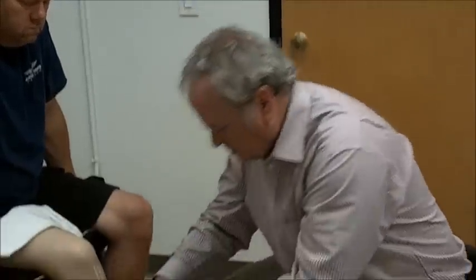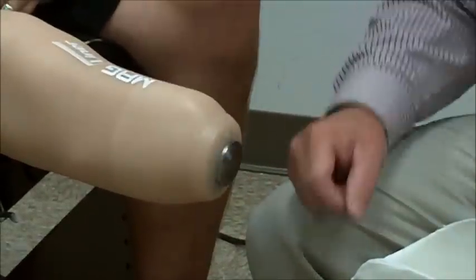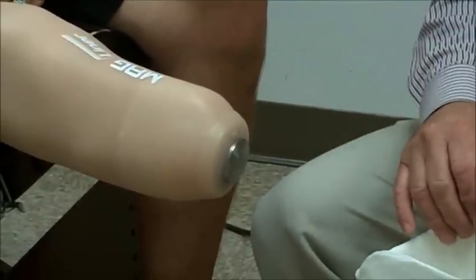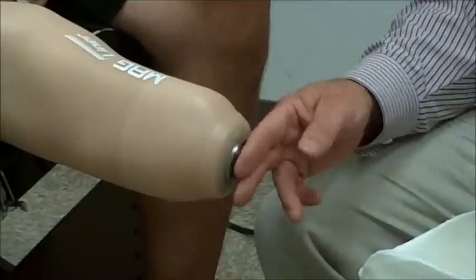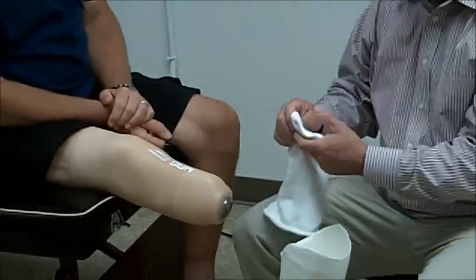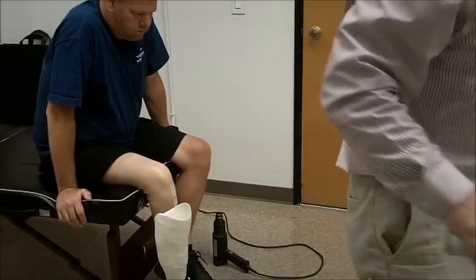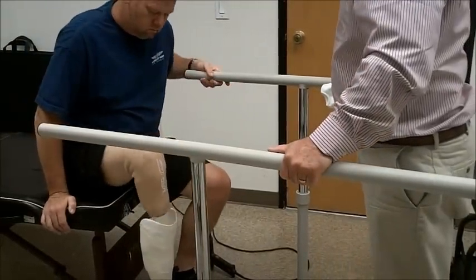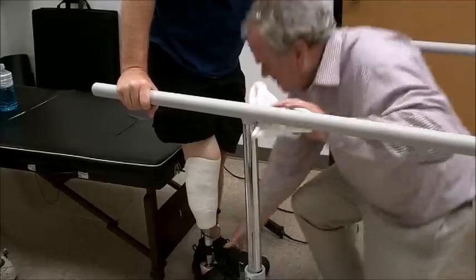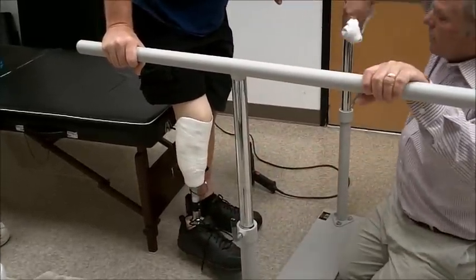The mag liner is different — it has a built-in 50mm target. We went from a little tiny 8mm target to a 50mm target to make it easier for the patient to find center. They can be 10 degrees off and still have enough metal contact for full suspension. KnitRight has made up a sock with a special hole for these liners. What I want you to do is stand in it until you hear the click — metal to metal. Do you hear that sound? Okay, now lift up. We have suspension.